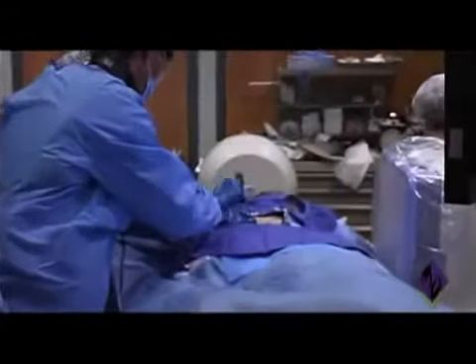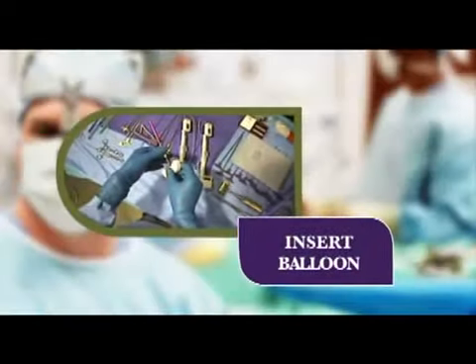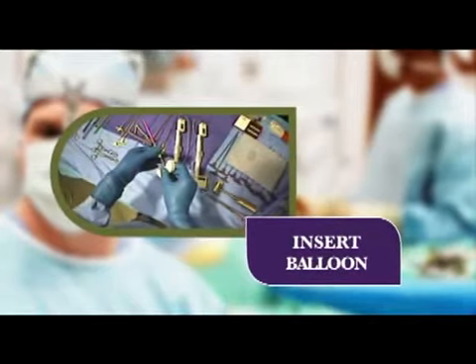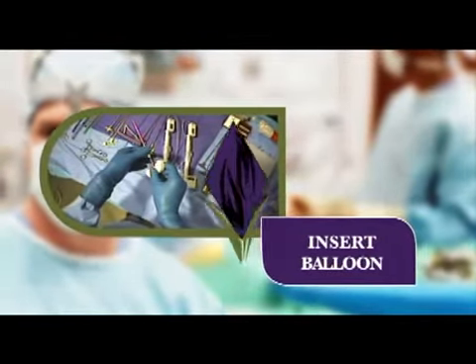We're now going to go to the other side. We're now ready to put the balloons in. And I think we're also ready to start mixing the cement.